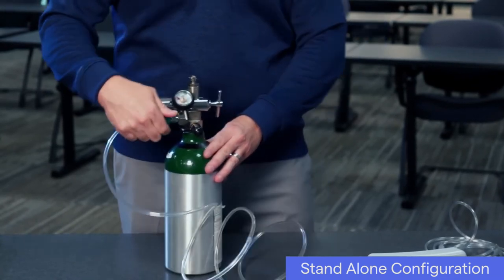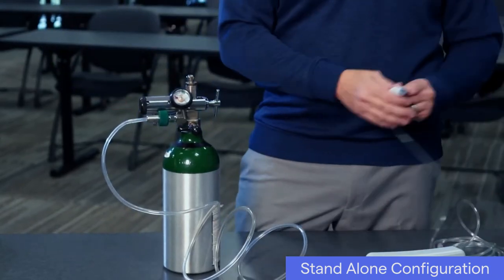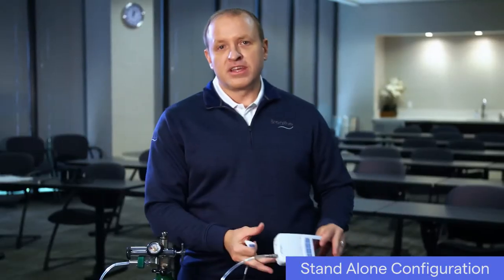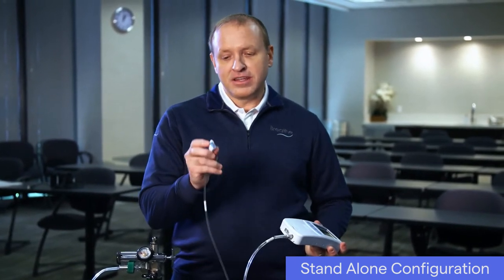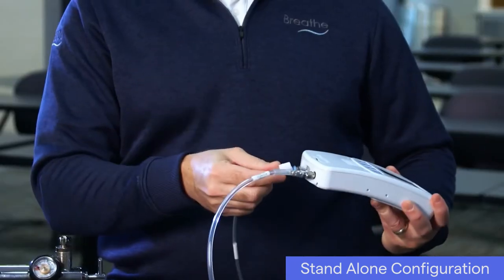To connect an interface to the ventilator, plug it into the interface connection on the bottom of the ventilator. It's keyed in a special way so that it will only fit in one direction.